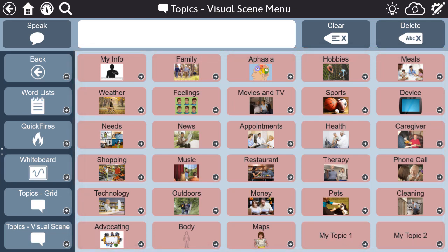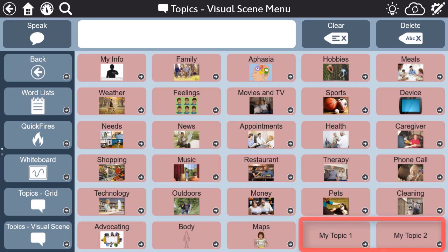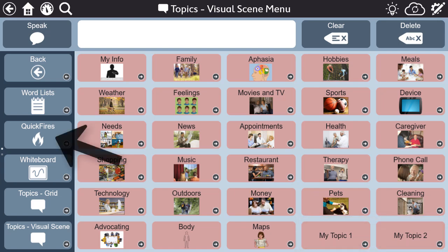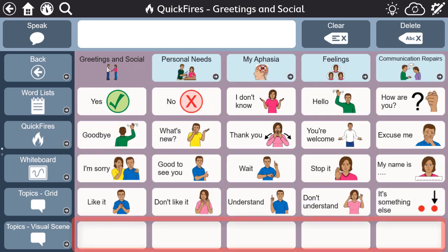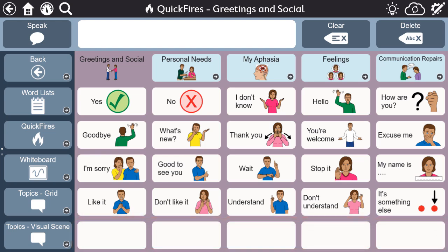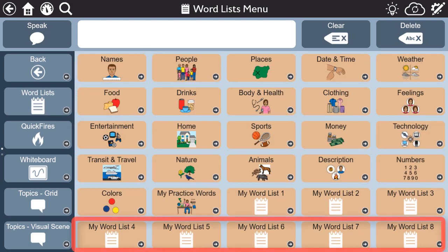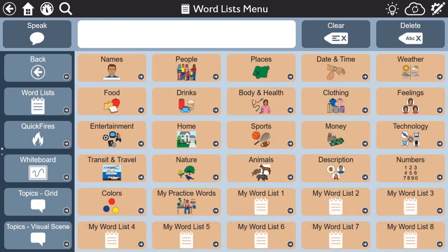Second, this is a user-friendly AAC solution, even if you are less familiar with technology. You'll notice blank buttons throughout the aphasia pages to encourage adding personal content whenever possible. We encourage you to customize topics, quickfires, word lists, and more.